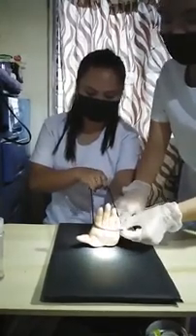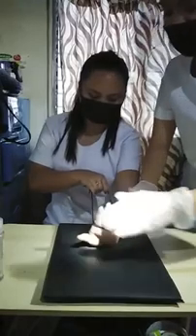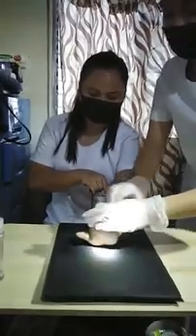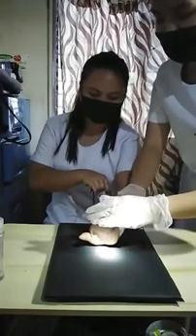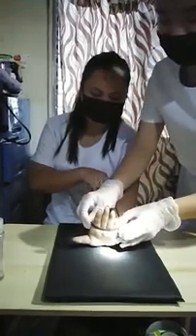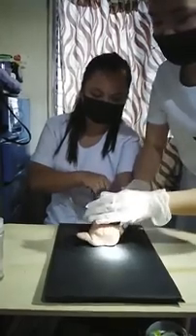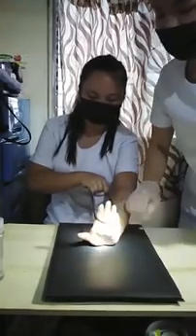The central ray, 1 inch distal to the base of the third metacarpal at an angle of 25 to 30 degrees in reference to the long axis of the hand. Purpose and structure shown. This view is for identifying abnormalities of the tissues in the canal and fractures of hamate, trapezium, and pisiform bones, and soft tissues of the wrist.